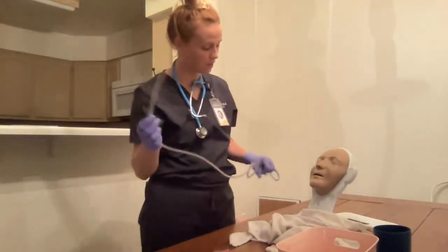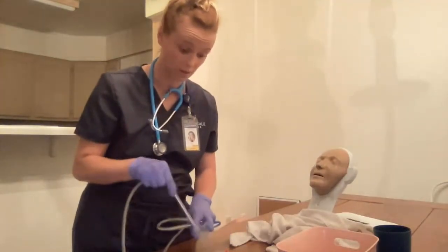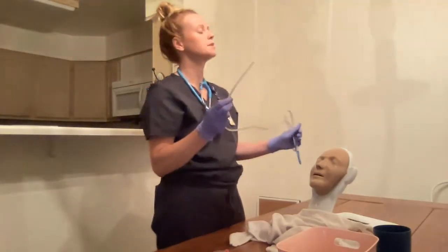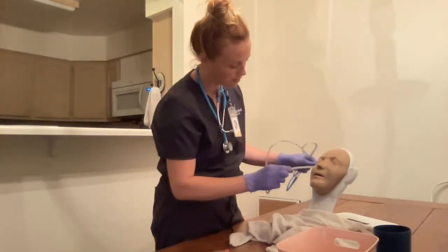All right, Mrs. Smith, are you ready? I'm going to insert the tube. I'm going to lubricate the tubing with the jelly. All right, Mrs. Smith, hyperextend your head, lean your head back. There you go. I'm going to insert, okay?